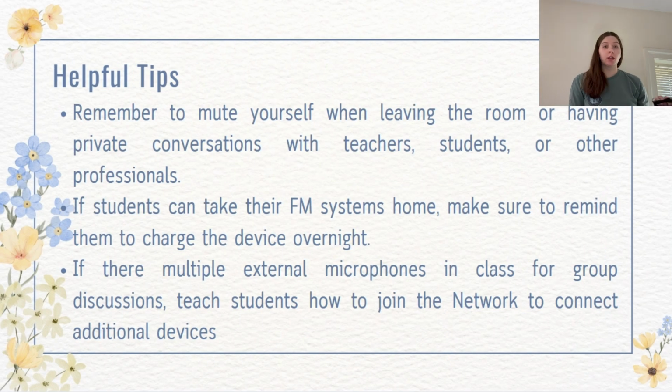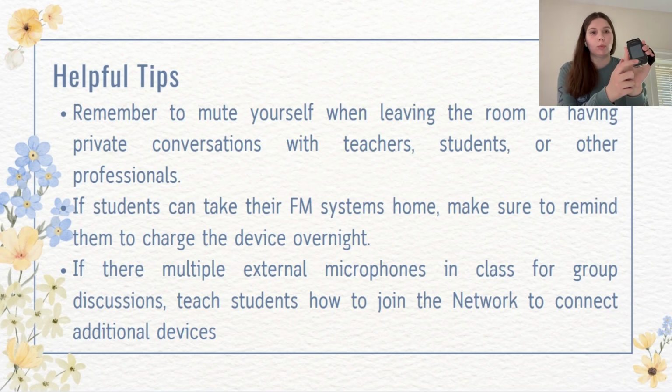All right, so here are some helpful tips. If you are going to be having a private conversation with a student or a teacher or leaving the classroom for any reason, you should mute the FM system, which you'll press this little button right here and you know if it's muted because it will have a flashing red light.